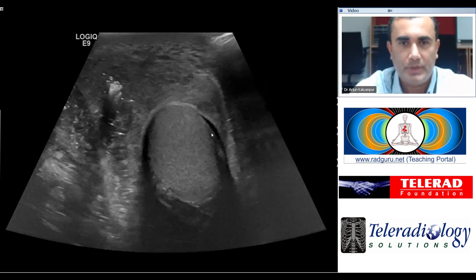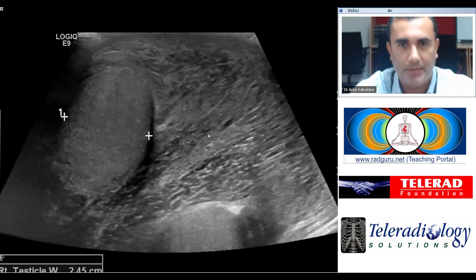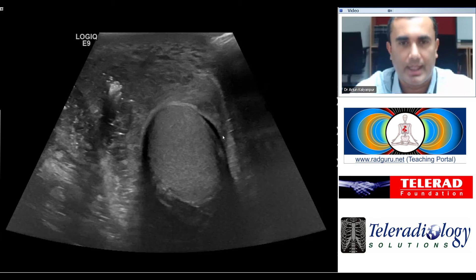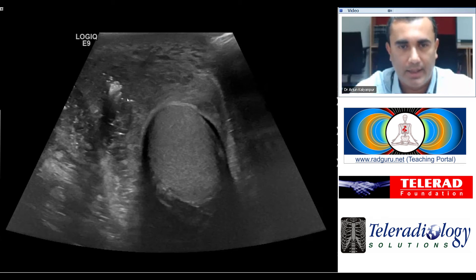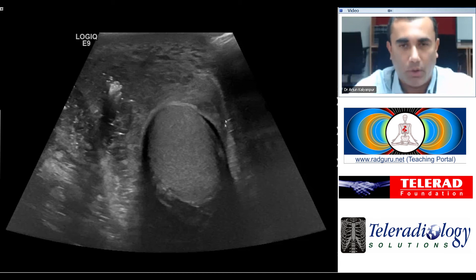This is a condition of extremely high morbidity, which is important for us as radiologists to recognize and communicate to the treating physician. When one sees these kind of echogenic foci in the scrotal wall, particularly with ring-down artifact as in this case, it needs to be immediately communicated to the treating physician so that an urgent surgical consult may be obtained.